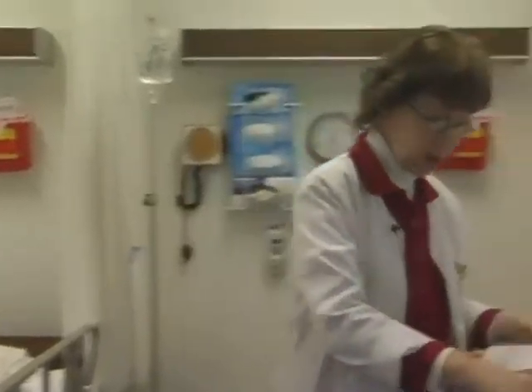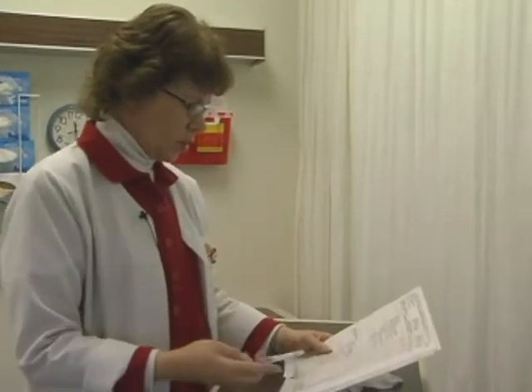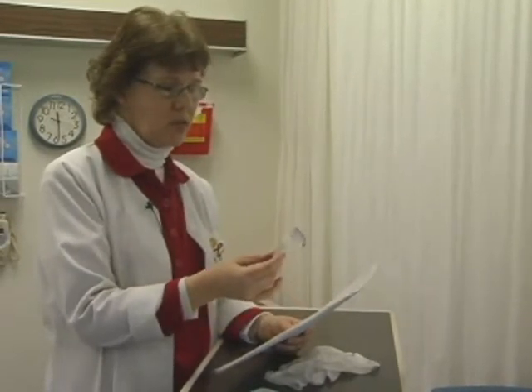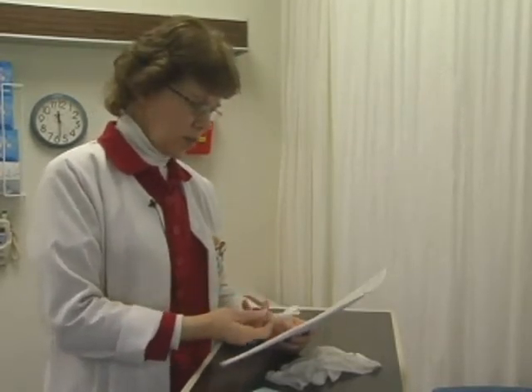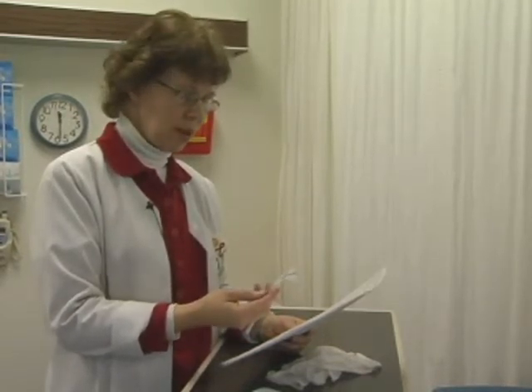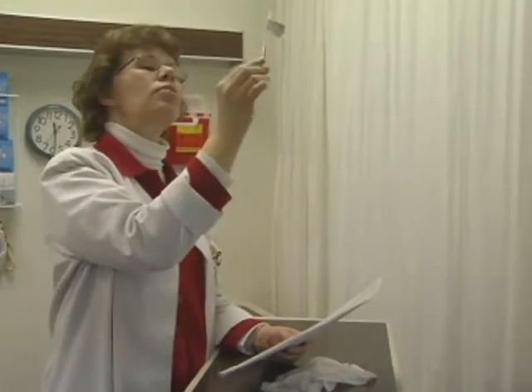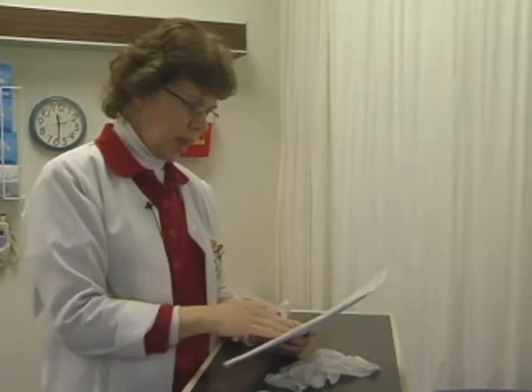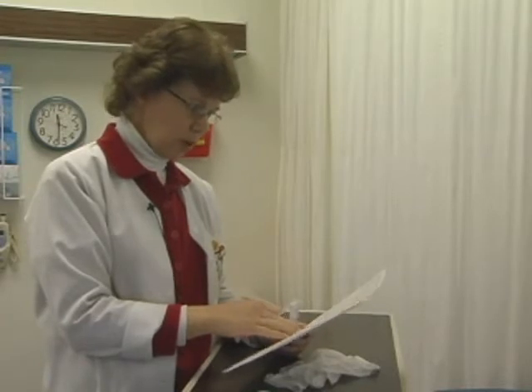Now I need to check my medication for the 3rd time. So I have Harmon Wagner, ID 47672. The medication is Zofran, and I have Zofran. The dose is 4 milligrams. This came 2 milligrams in 1 ml, and so we calculated 2 ml, and I have 2 ml in my syringe and no air bubbles. It's ordered IV push, and I do have an adapter, and every 4 hours as needed for nausea. He had it last at midnight. This is 8 a.m., so it's been more than 4 hours, so it's safe to give.